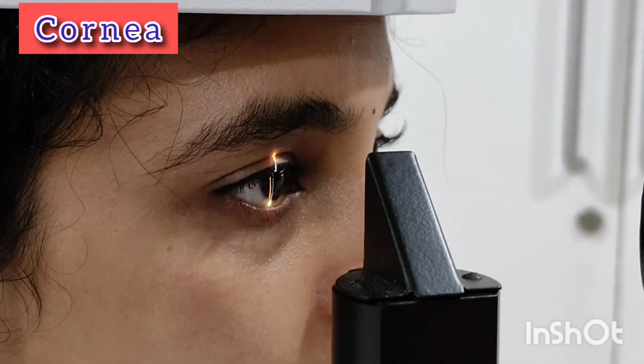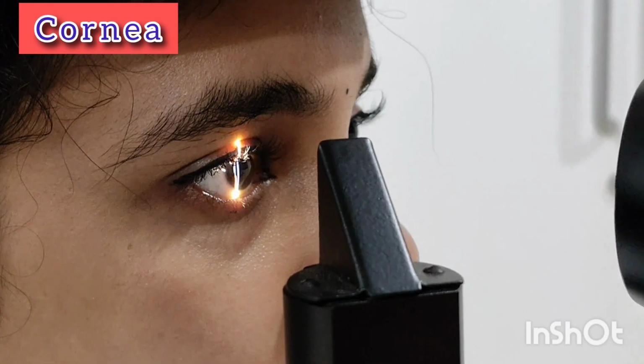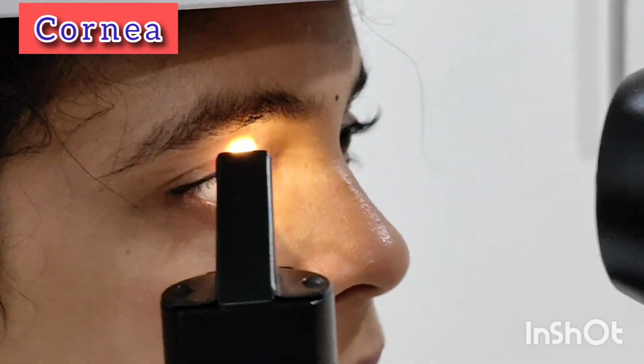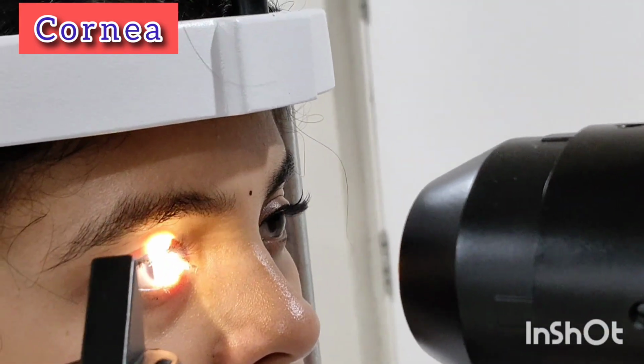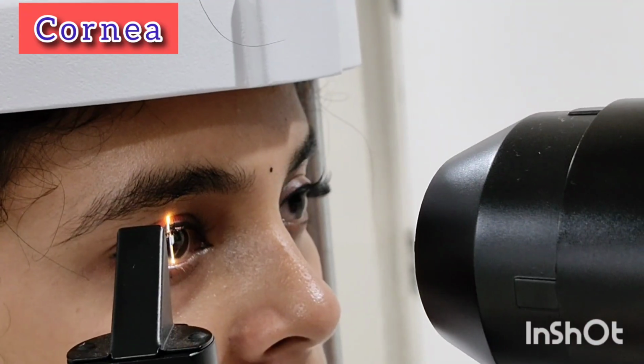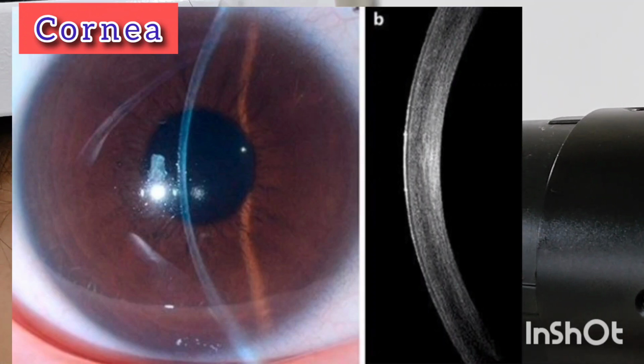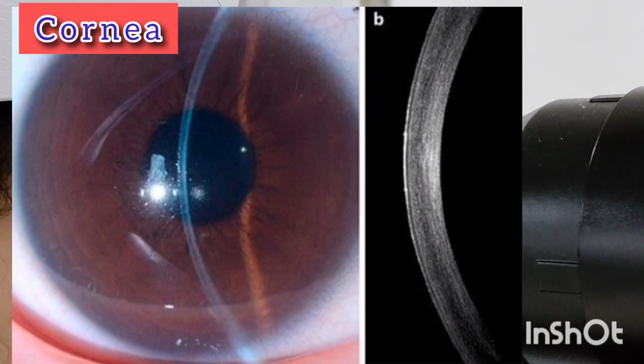Next is slit lamp examination. We should go for the cornea examination. Start with the diffuse illumination to see overall structure, then make a slit and focus clearly from epithelium to endothelium. All layers should be visible clearly.